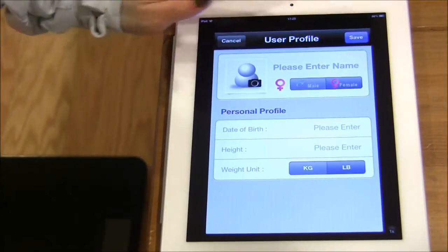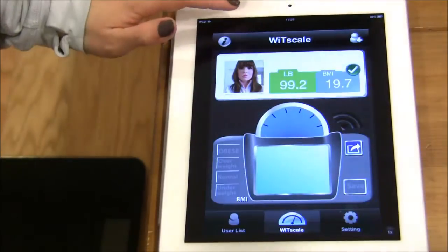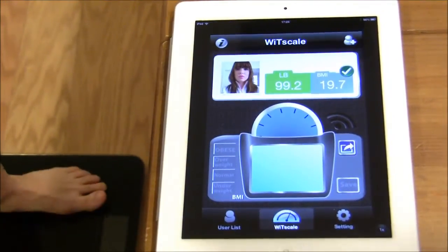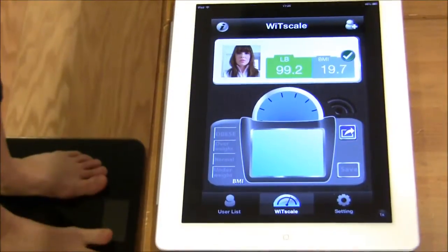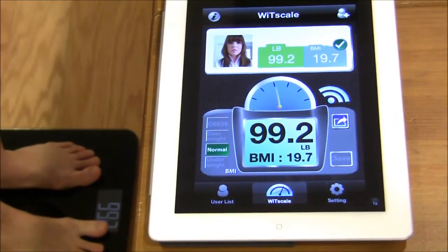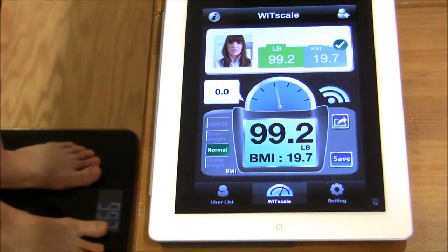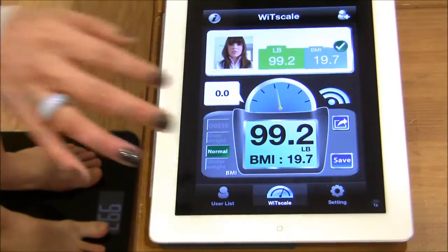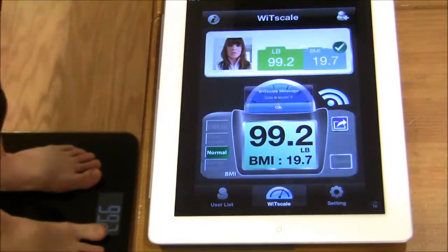I have already created a user profile. Now you may step on the scale. After it has taken your weight, you may see this information.